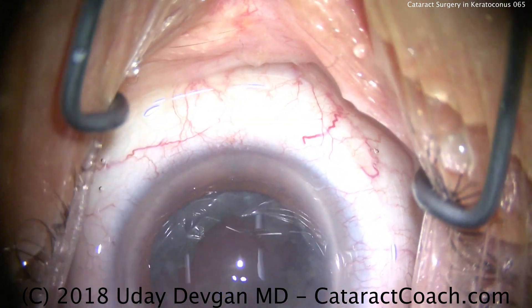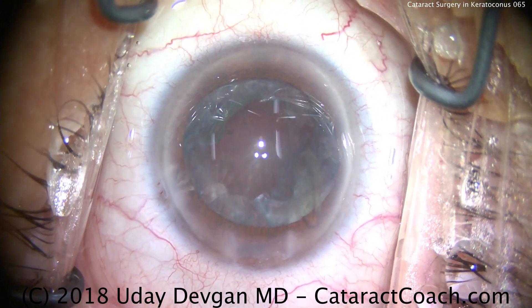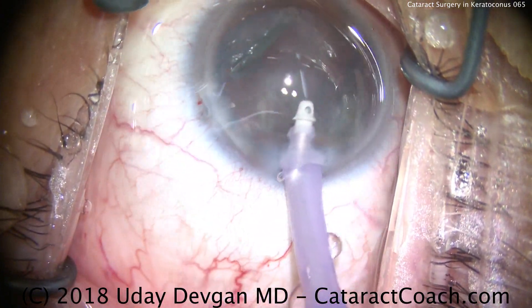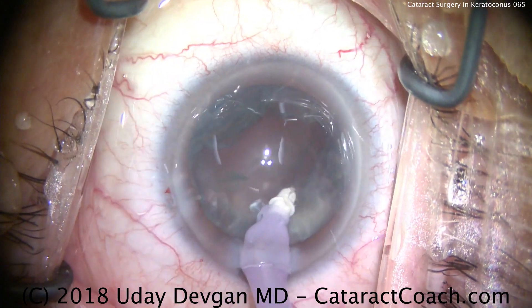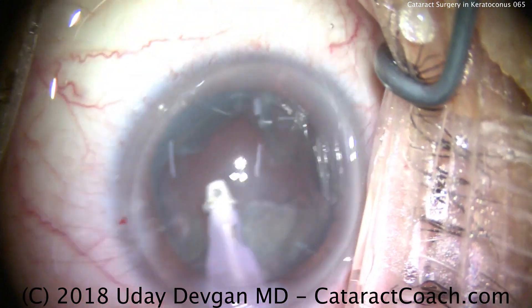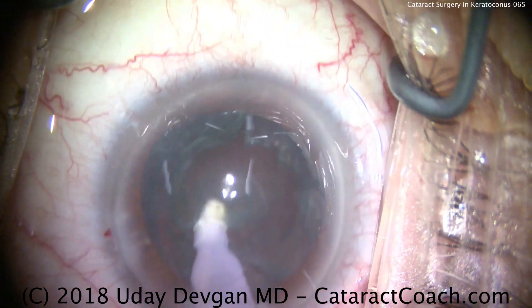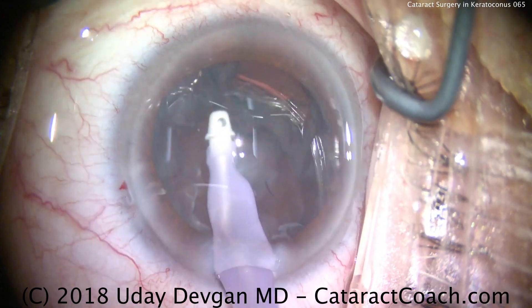When calculating, tend to use a little bit lower value of the central corneal power. So if many of the devices read 55 and one says 52, I may choose the one that says 52. By choosing a lower corneal power, we'll select for a higher power IOL, and the patient is more likely to have a slightly myopic outcome. In these eyes, we want a myopic outcome — in fact, in this case we're aiming for about minus two or minus three diopters of residual post-operative myopia. That way the patient can go back to his hard contact lenses, which can be quite successful. Definitely want to avoid any post-op hyperopia.